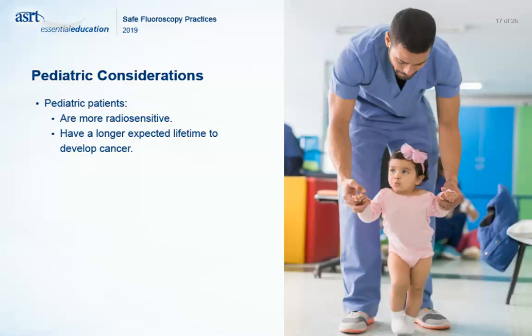In addition, pediatric patients receive a larger radiation dose than is necessary to produce a useful image when the fluoroscope uses equipment settings designed exclusively for adults.